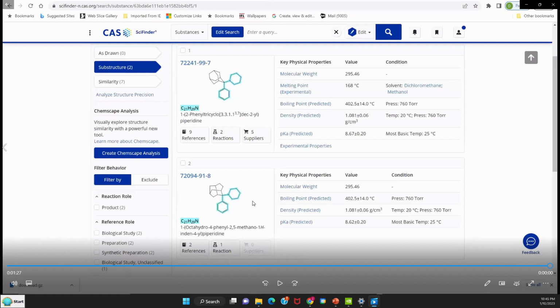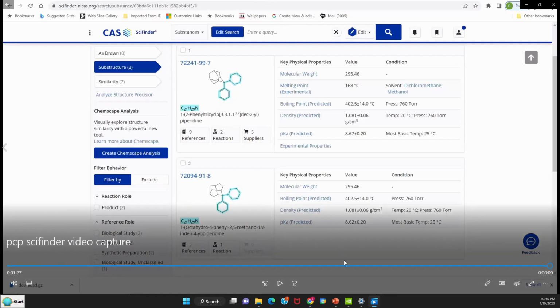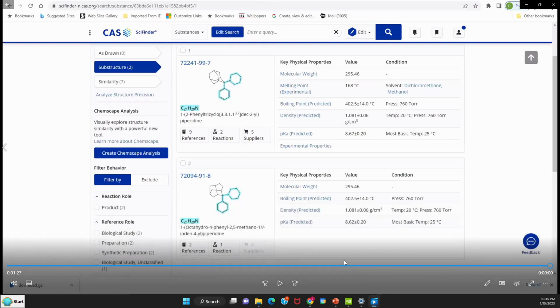So you can see this is a much easier approach. If you look at the presentation, we used a lot of chemistry. This is much more directly easier to do. And I also did the same thing in ChemSpider and get similar results. So you could do it either way. You've got to remember that CAS is fee-based, you pay for it, and ChemSpider is free. We'll now try another compound that we identified in the presentation using SciFinder.